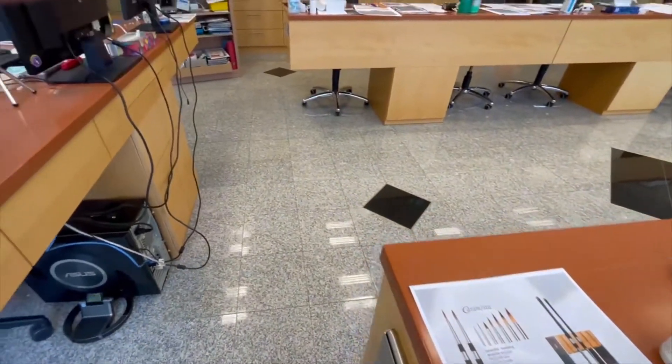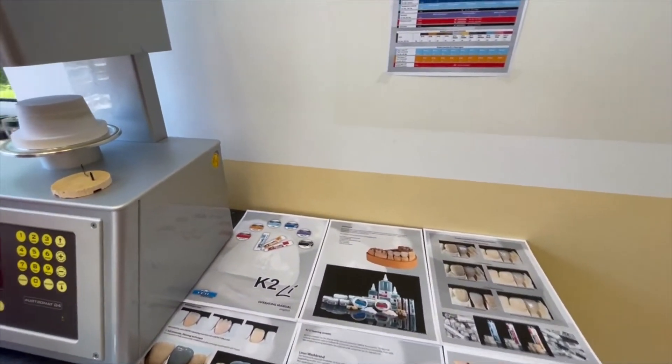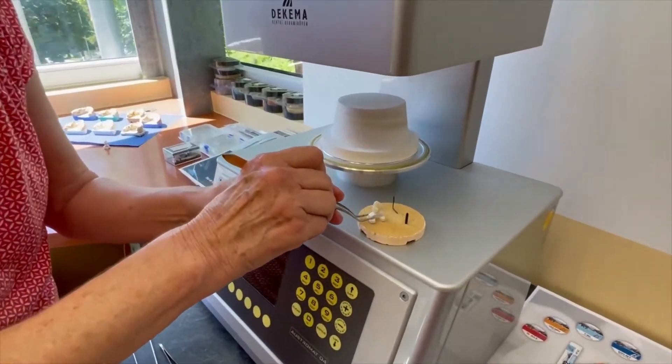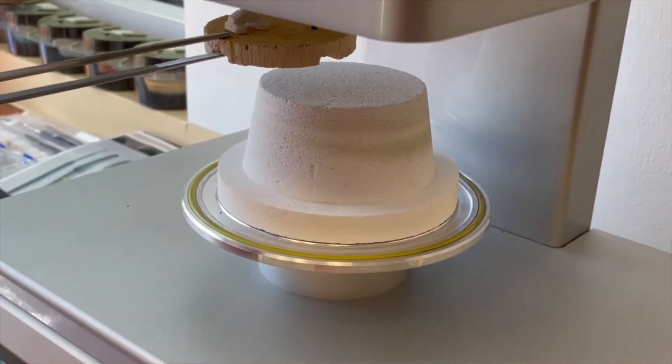You can see everything is working very fast. We change to our furnace once again. Andrea sets the crown on and brings it to the furnace — this is the last firing.